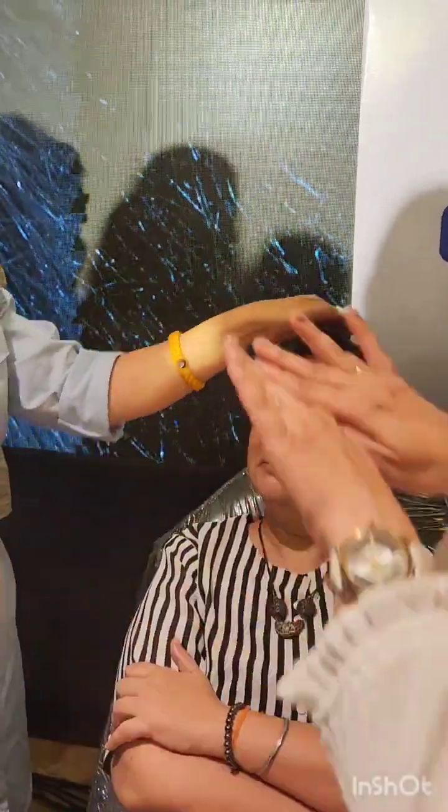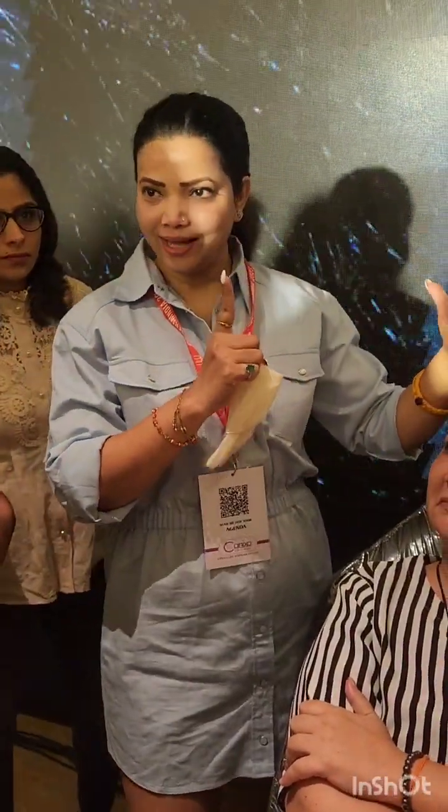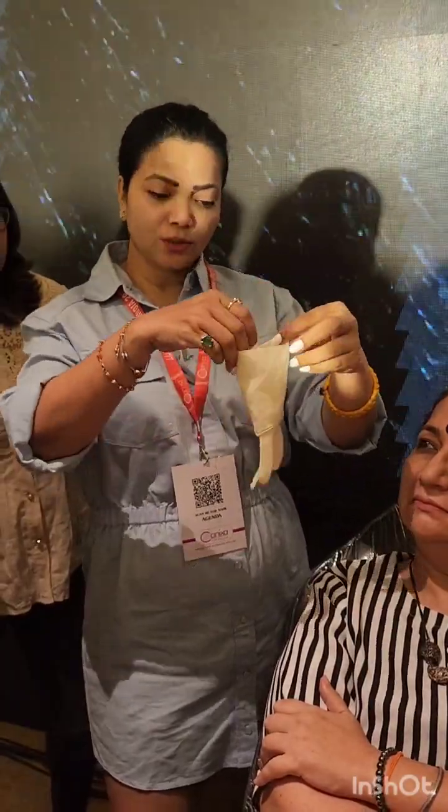Those are mono threads only, but smaller ones, because the scalp has a curvature, right? It's convex. A needle is straight, so you won't be able to manipulate. So that is why choose your needle, and don't choose double screw because we don't need fibrosis here. We just need growth factors to be released, right? Go a little behind, so that you also get space because she needs to do the injection. Scarring alopecia, correct. Mono threads are intra.